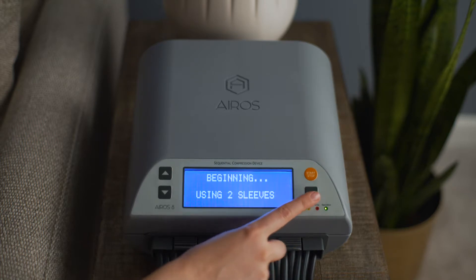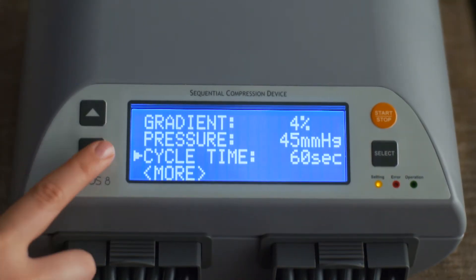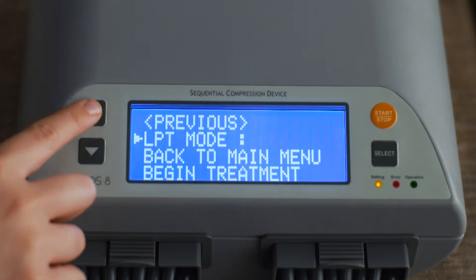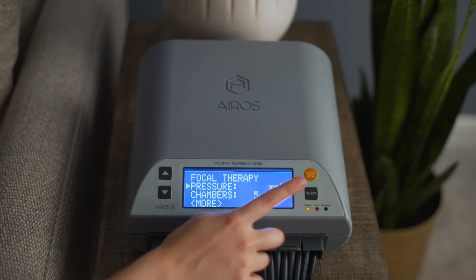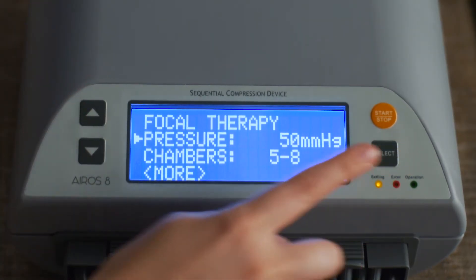To operate the device with focal mode, from the gradient mode setup screen, scroll down to LPT mode and press the select button. The mode will start blinking. Scroll to focal and press the select button. To set the pressure, scroll to pressure and press the select button. Pressure can be set at 40, 45, or 50 millimeters of mercury.